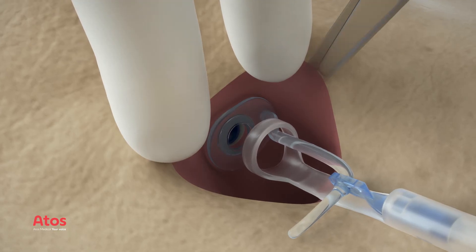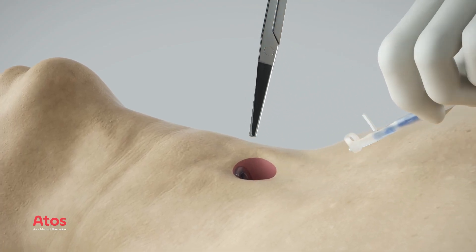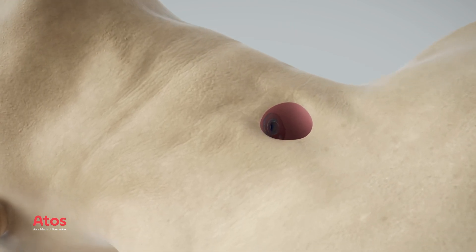Turn the prosthesis in the correct position and cut the safety strap. The secondary placement of the voice prosthesis is complete.